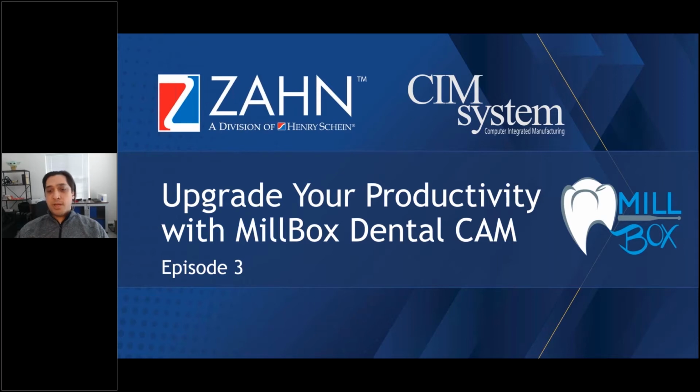Whether you're a pre-existing MillBox user on an old annual maintenance revision, you're going to see some newer features that may entice you to take advantage of those update possibilities. And if you're a Sum 3D user, which is our legacy CAM software that predated MillBox, there's never been a greater time to upgrade to MillBox. So you'll be able to see the stark contrast in features here as well.